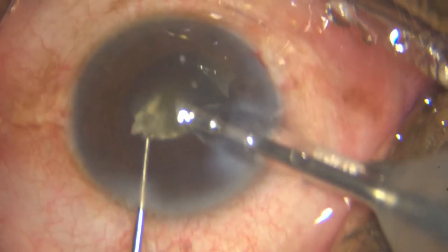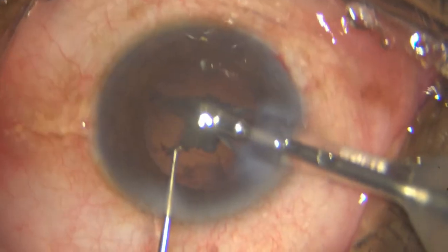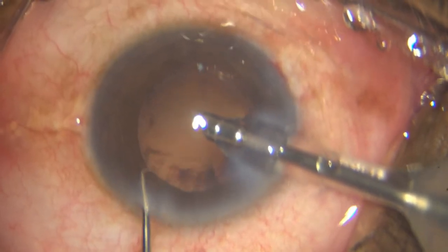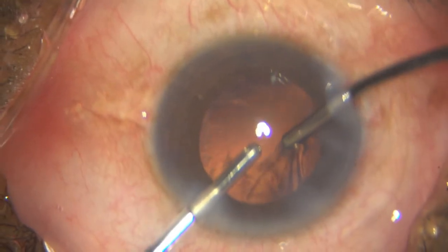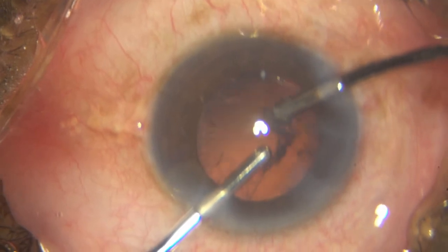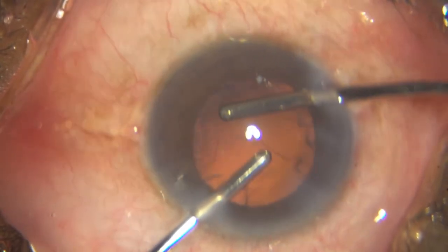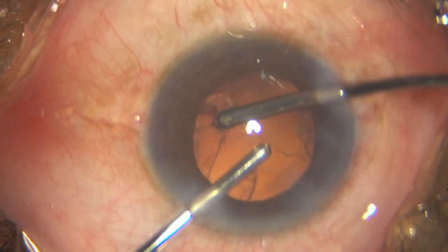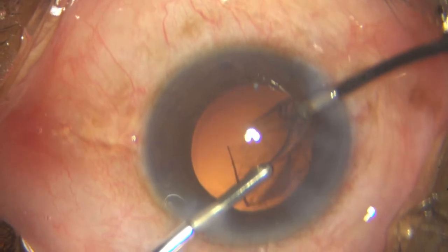The more you achieve that, the clearer your cornea is going to be the next day. Yes, FACO time matters, FACO power matters — all of that matters — but the most important factor I believe is the distance from the cornea. Even if you use low power and low time, but if you are FACOing close to the cornea, you are going to get corneal edema. And that is a fact.